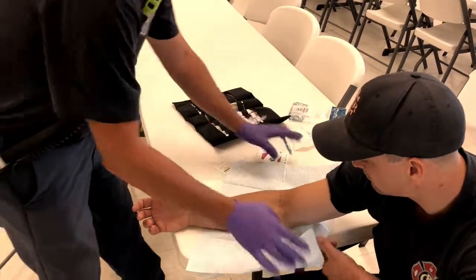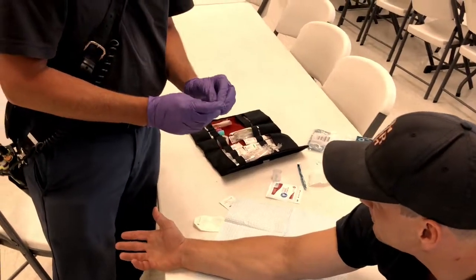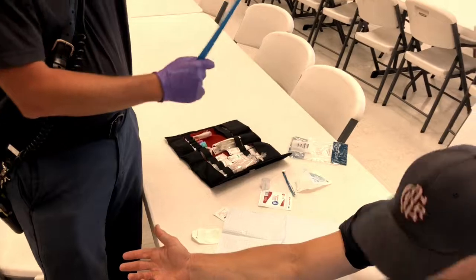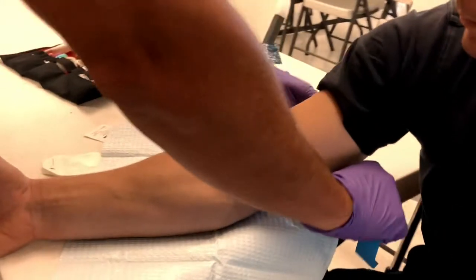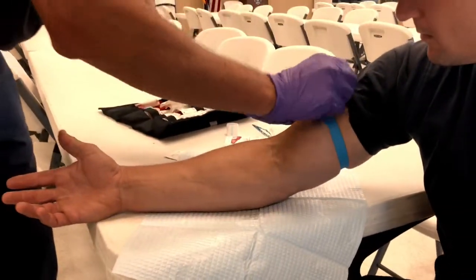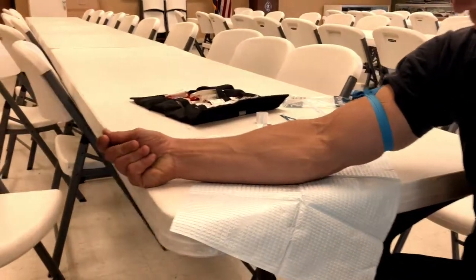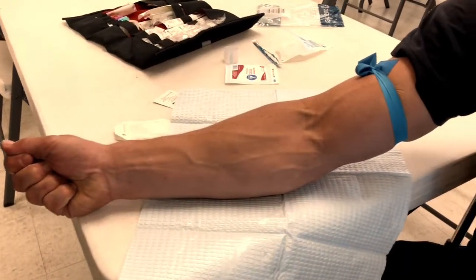We always start up high. Grab that, thank you. Tourniquet the arm above all IV access. So we have lots of opportunity to make it good and tight so we get a good fill of our veins.